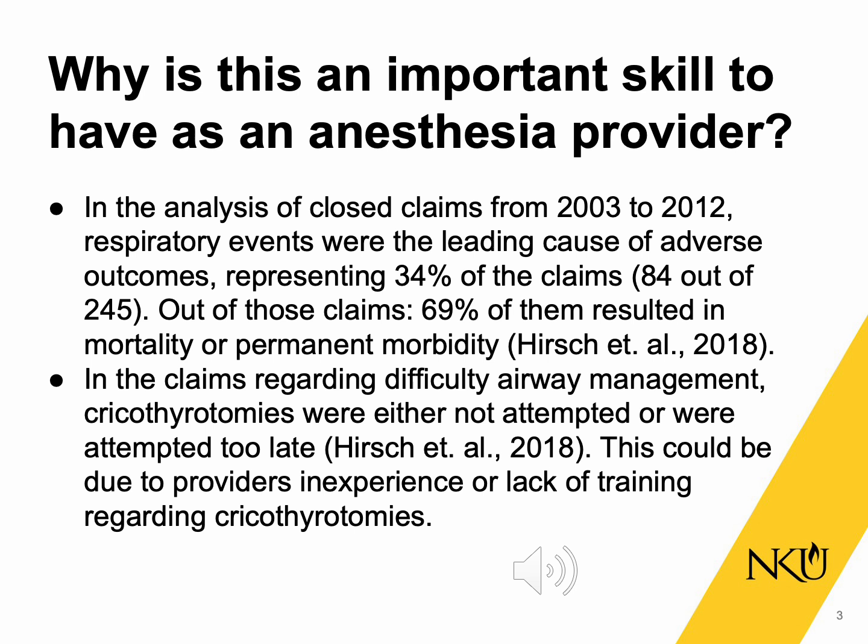In a recent study, success rates for cricothyroidotomies were as low as 34%. One common reason for unsuccessful attempts includes misidentification of the cricothyroid membrane. Throughout the literature, identifying the cricothyroid membrane with the ultrasound is a superior technique in comparison to palpation.